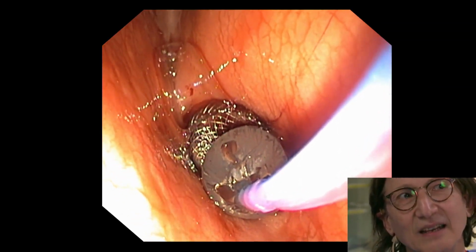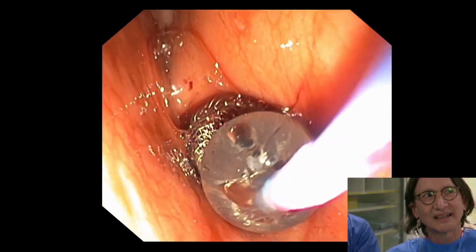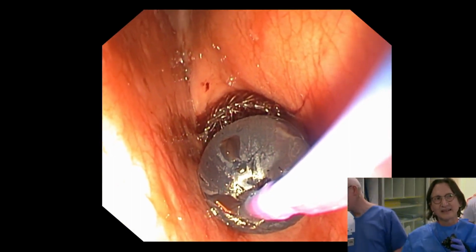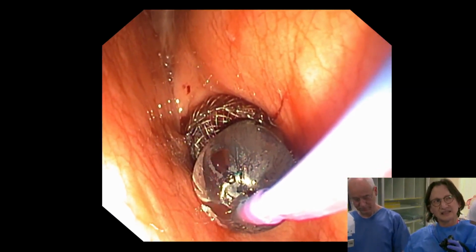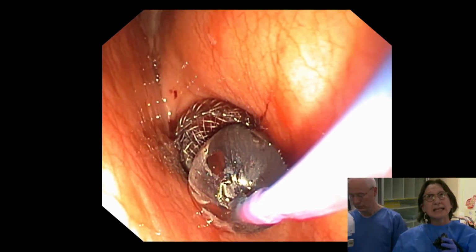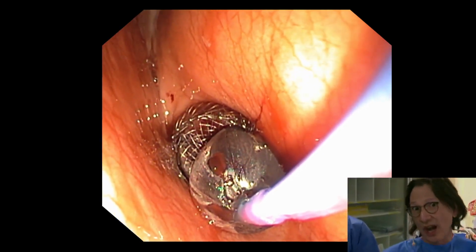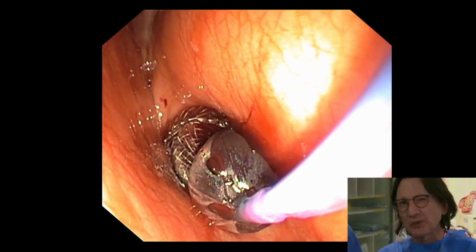Ken, I'm going to be asking you the question relating to the pylorus. So, what if when this expands fully, there is a degree of pyloric obstruction? I don't think there would be, as you said. What would you do to mitigate this? Well, if it became an issue that it really is obstructing, then I think you might just exchange out for some plastic stents. But I think this would be so rare.